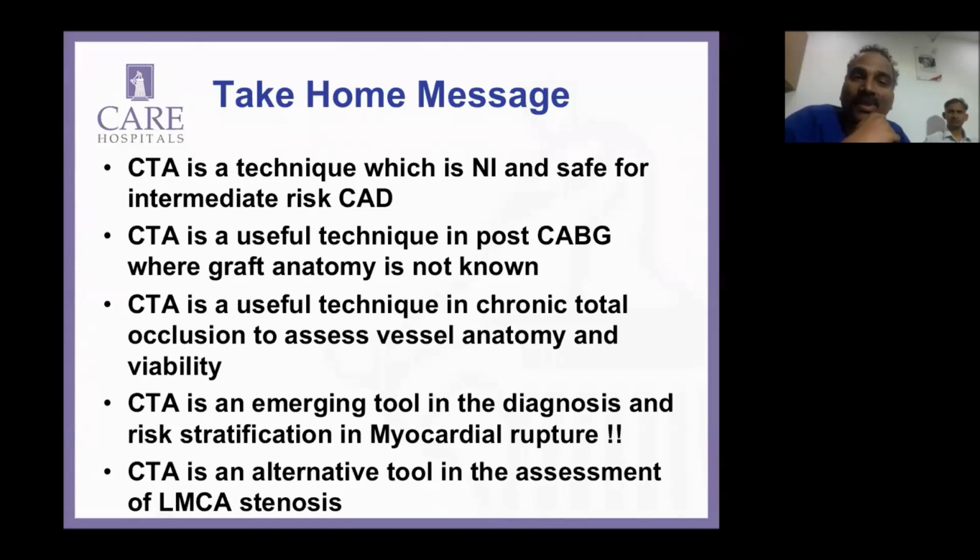And you can say it is invisible only provided you have taken longer injections, especially of the contralateral coronary. You have to spend enough time on injection. That is very, very important before you utter that word invisible. Despite all effort, even if it is invisible, then it is always wise to do a CT angio. Even if you want to plan a procedure, CT angio is definitely mandatory in those patients.